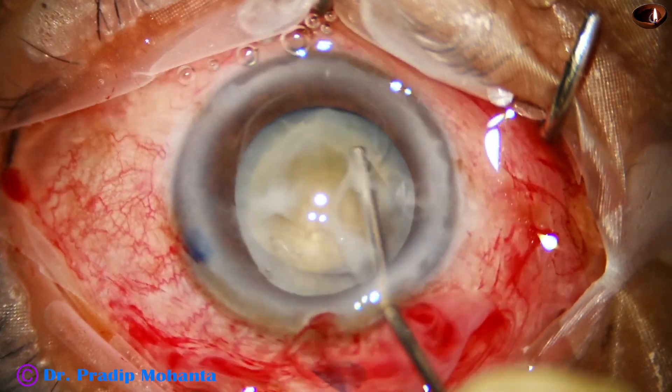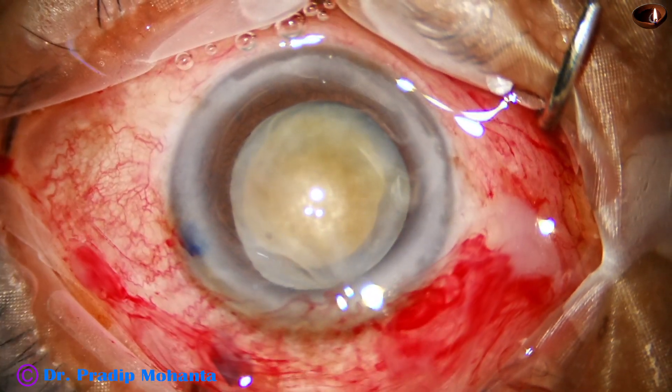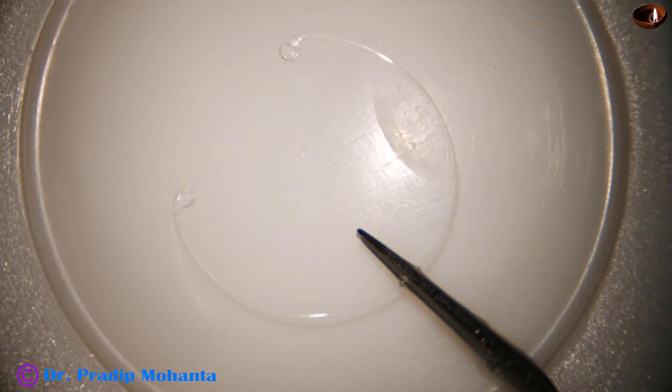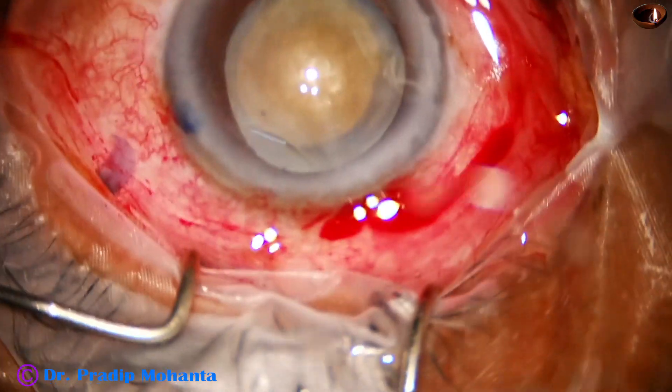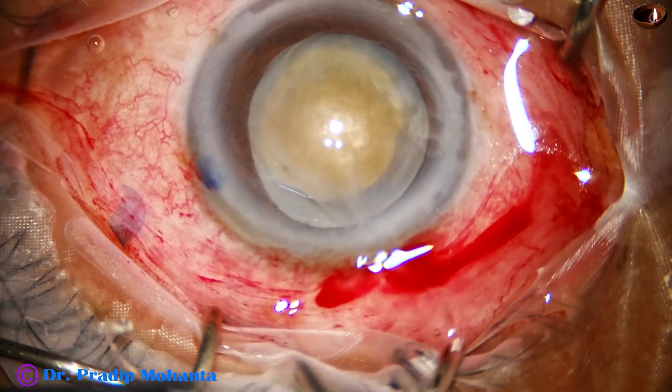In such cases, the decision has been made to insert the capsular tension ring at this early moment, because in many cases the zonule is so weak that zonular dialysis occurs during surgery. To support the capsular bag, the capsular tension ring — CTR — is inserted now.